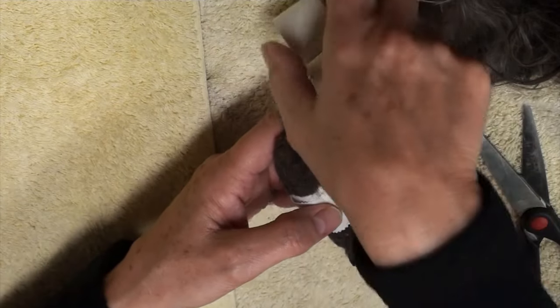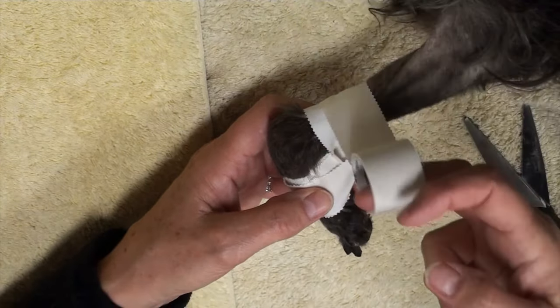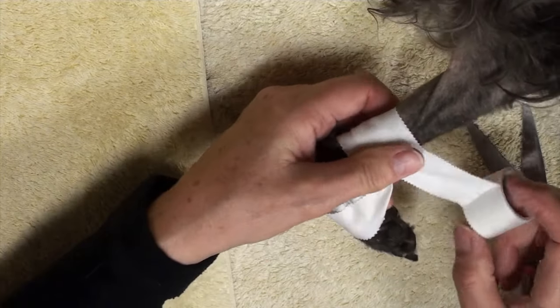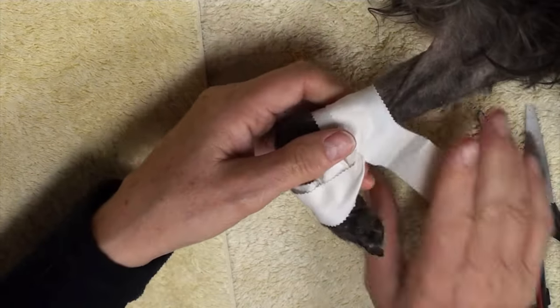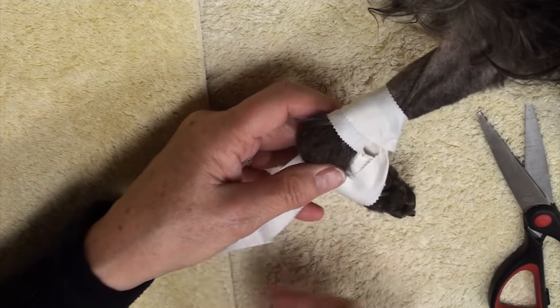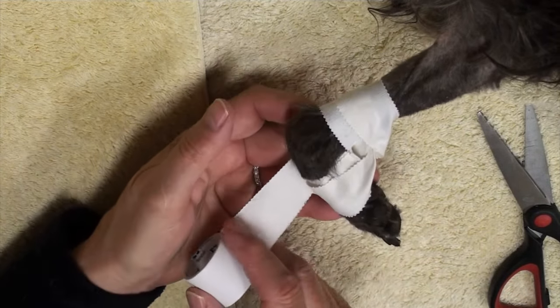You go between the radius and back down towards the metacarpals. It's nice to have the tape sticking directly on the skin because then it stays there.